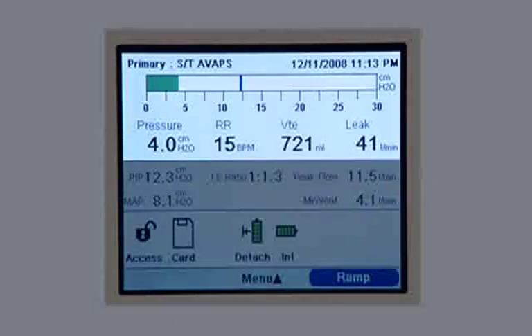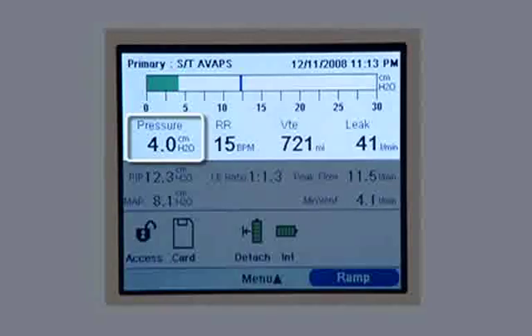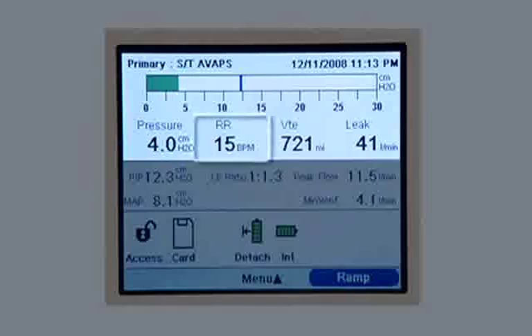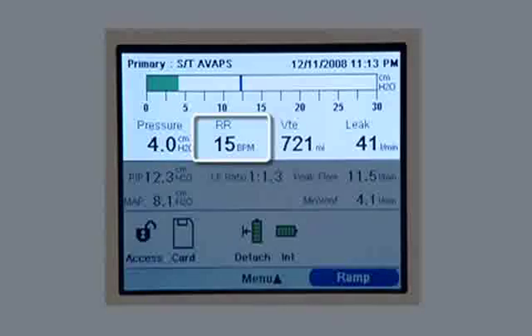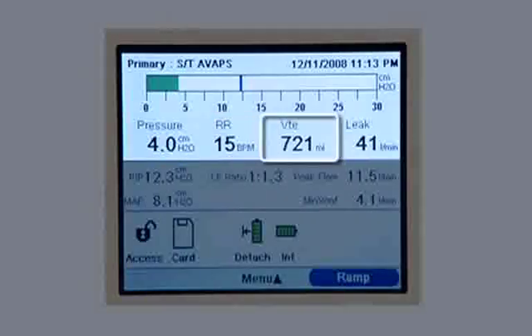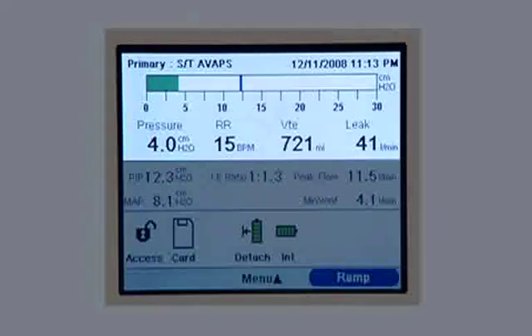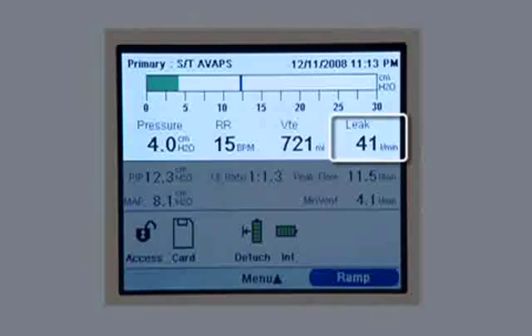The detailed screen provides additional clinical information. Below the bar chart, the patient's pressure appears measured in centimeters of water. RR, or respiratory rate, tells you how many breaths per minute. Tidal volume is given in milliliters. If you have a passive circuit attached, you'll see a measurement of leak in liters per minute and exhaled tidal volume.